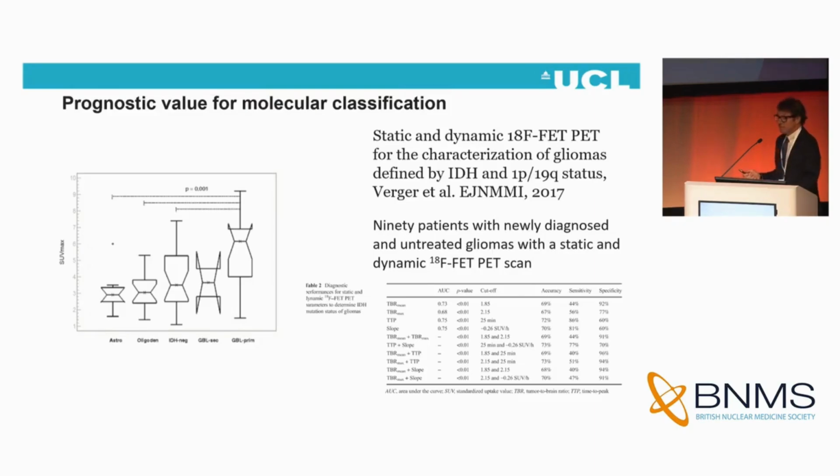So Professor Chalmers introduced the importance of the new classification that completely replaces the previous one proposed by WHO in 2021. Many papers have come out trying to compare and correlate the aggressiveness of a tumor based on the molecular classification and quantitative parameters. As you see, the more intense the activity, the more aggressive the tumor.